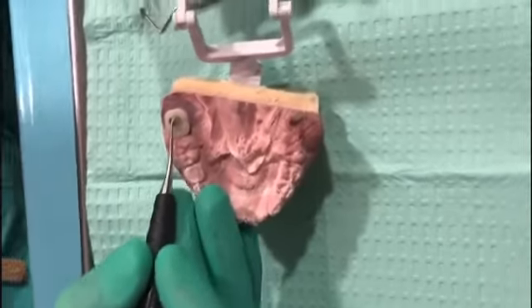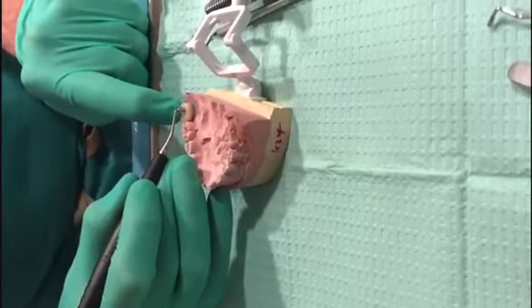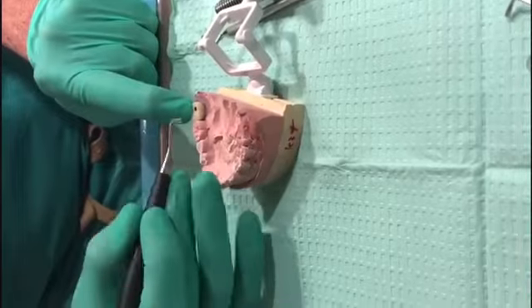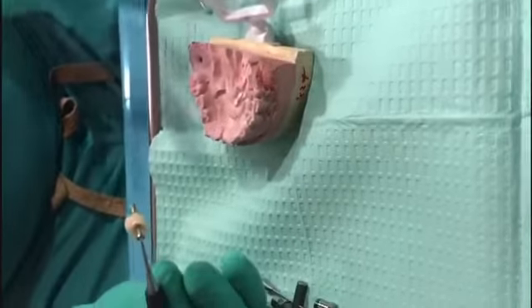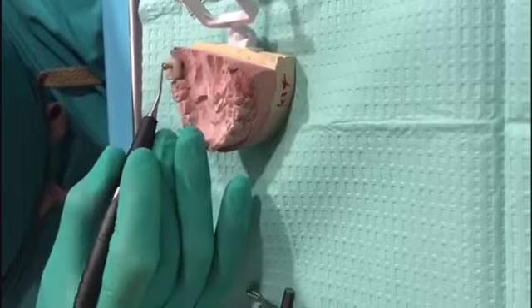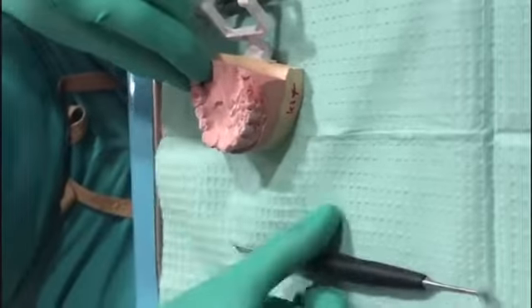I always recommend: once you insert it, put a finger on it to hold it and give counter-torque, then remove the instrument — otherwise you'll pull it right back out again. If you don't hold counter-torque it'll come out, so be cautious. We don't want your patient swallowing crowns or abutments.